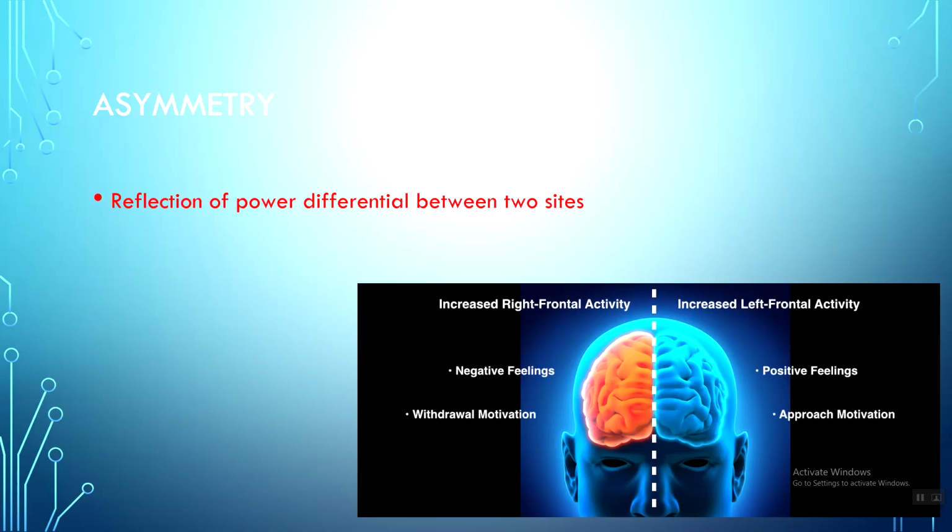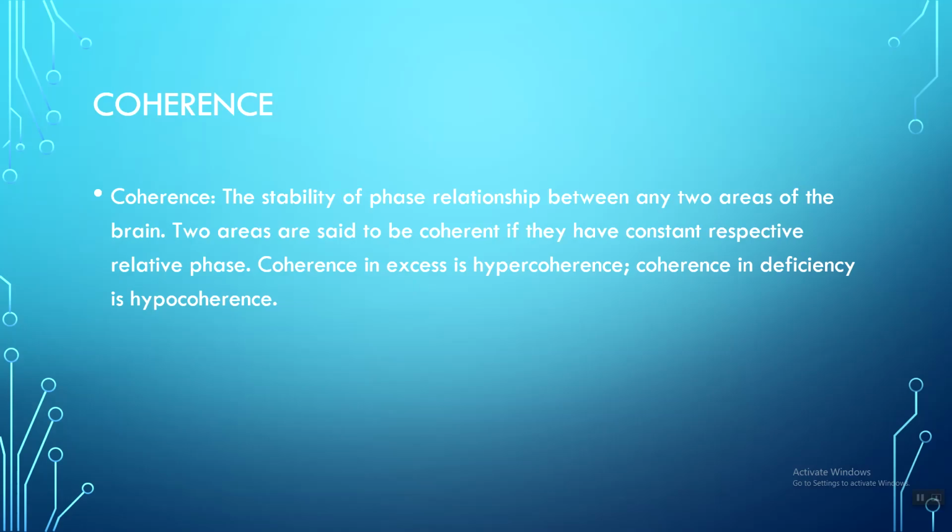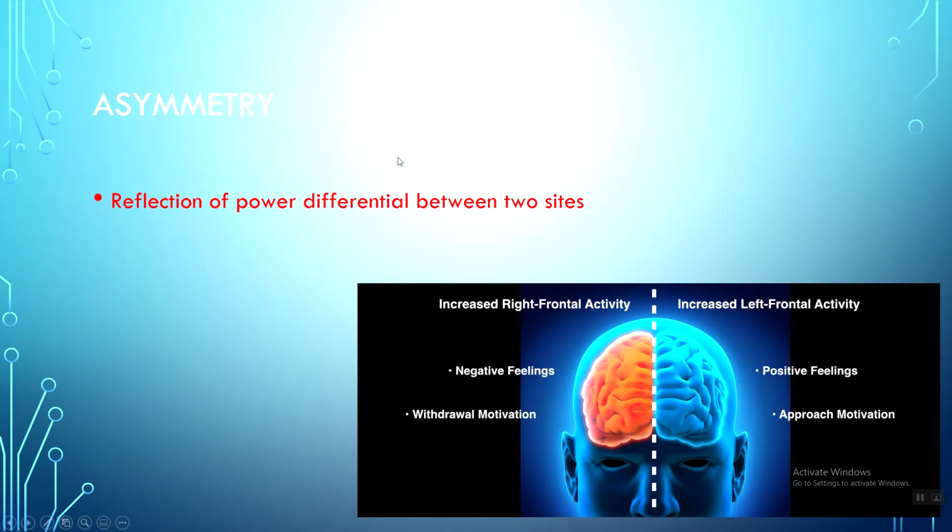I don't spend a lot of time on asymmetry. That was quick. Very quick. Forget about it. Asymmetry is going to be reflective of a power differential in the brain.